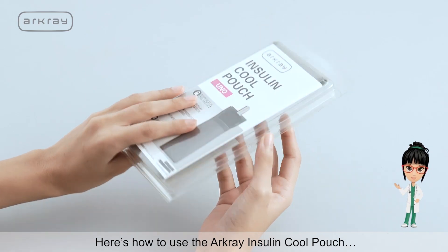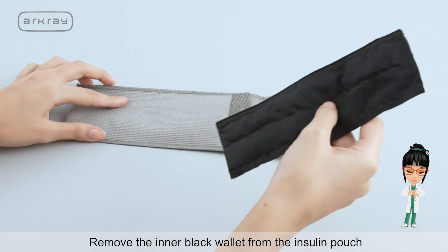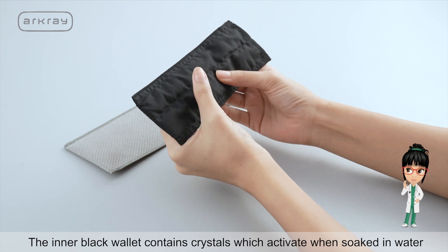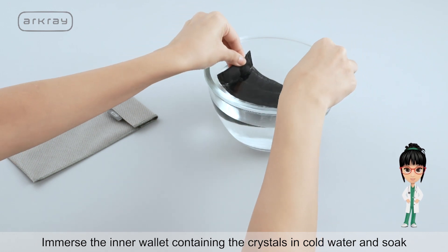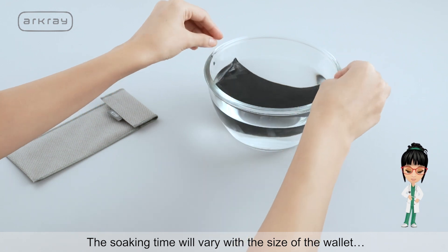Here's how to use the Arkray Insulin Cool Pouch. Remove the inner black wallet from the insulin pouch. The inner black wallet contains crystals which activate when soaked in water. Immerse the inner wallet containing the crystals in cold water and soak.